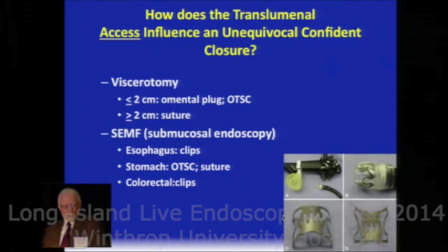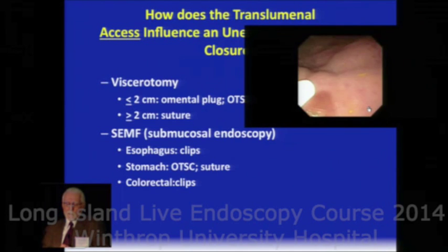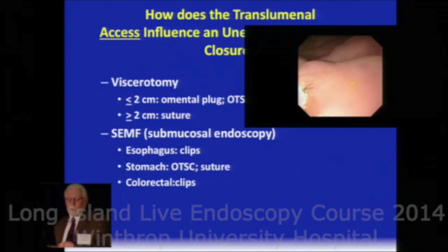If you have a viscerotomy that's greater than 2 centimeters in size, nowadays the only real answer to deal with that is by suturing. When we shift into submucosal endoscopy, I'm going to run this video, and you can watch a submucosal procedure in the stomach. Our choices, again, can be varied.